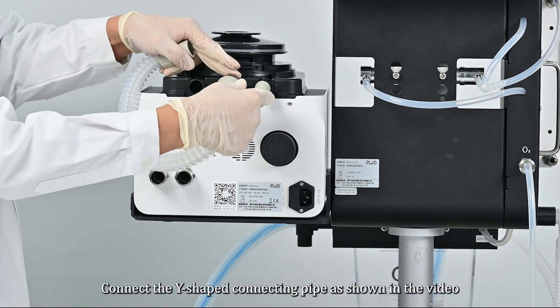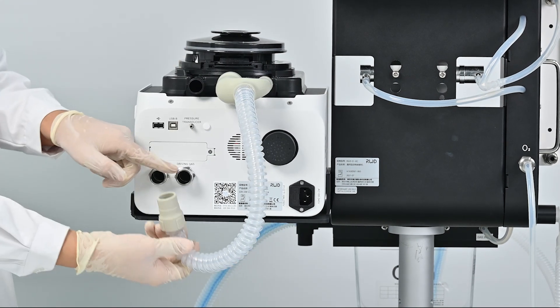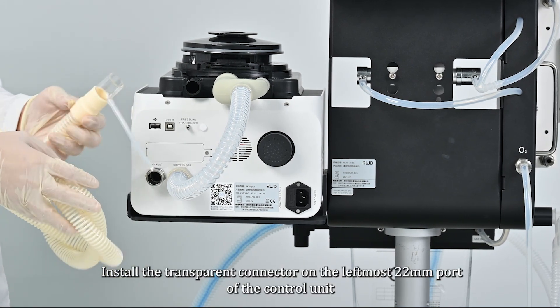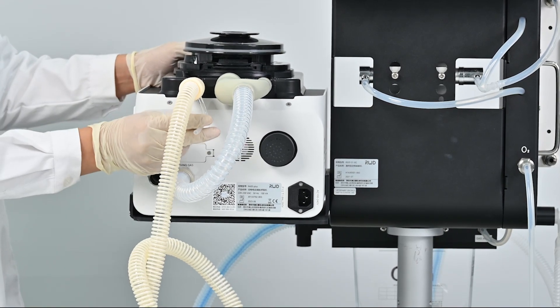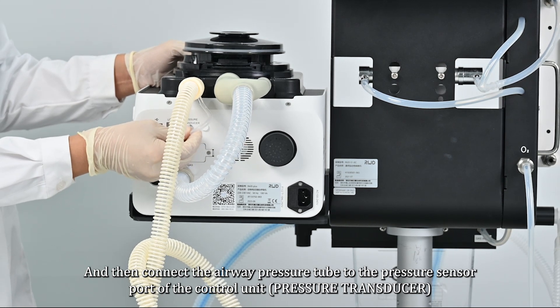Connect the Y-shaped connecting pipe as shown in the video. Install the transparent connector on the leftmost 22-millimeter port of the control unit, and then connect the airway pressure tube to the pressure sensor port of the control unit.